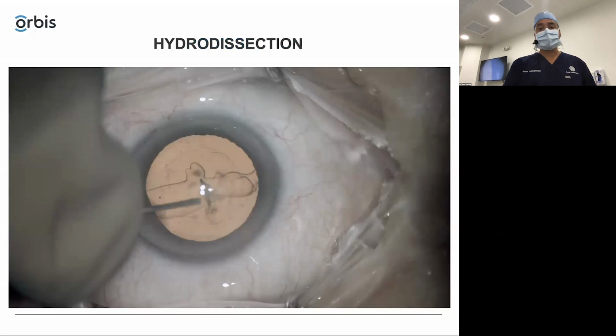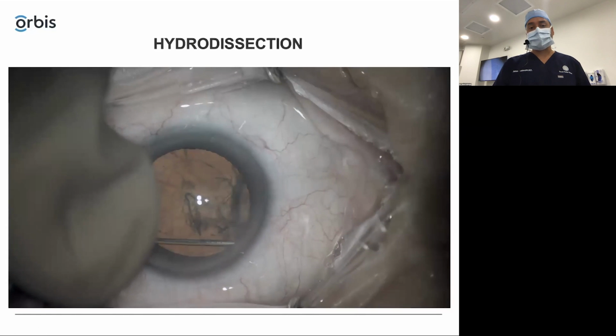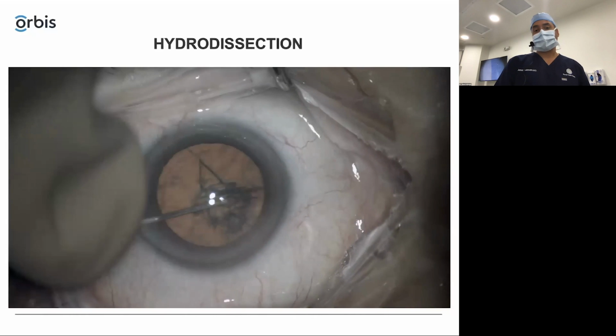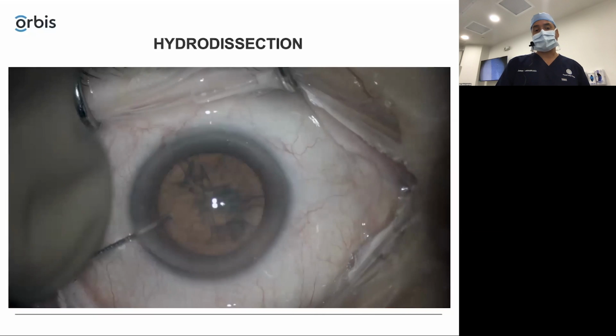Now hydrodissection, oh, hold on, let me go back there. Hydrodissection is where you go right under the anterior capsule and inject fluid. You can see that nice fluid wave there, and then you ballot down to keep the nucleus free. And then you want to confirm, I'm going to go there again a little more. You want to confirm that you can rotate it.